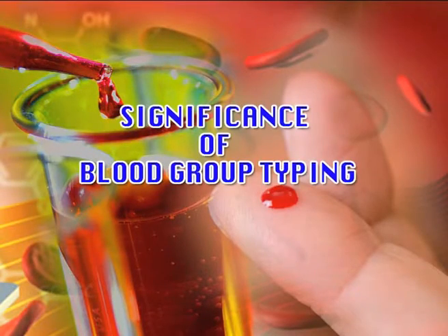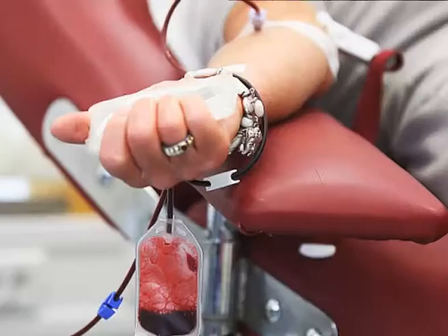Significance of blood group typing: ABO grouping is required for all of the following individuals: blood donors and transfusion recipients. Blood typing is done prior to a blood transfusion or when classifying an individual's blood for donation. If individuals are given incompatible blood, it can lead to blood clumping or agglutination, which can be fatal.